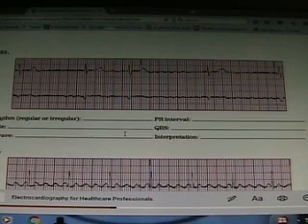Now, we're going to add a new wrinkle. Of course, every week, you guys are going to get a trace from me, and then it comes out, right? You already know how to identify what's normal and what's abnormal. But this is what I'm going to do to you now. Now I'm going to have a piece of paper and say, this came out. What is the diagnosis? And that will be part and parcel of your weekly quizzes, of your weekly practicals. Because remember, I'm trying to simulate real life as much as I possibly can.